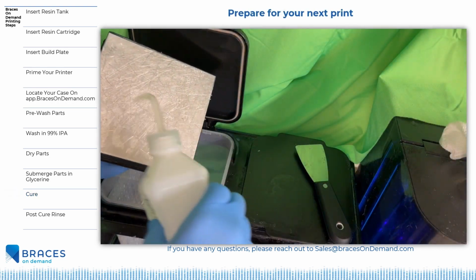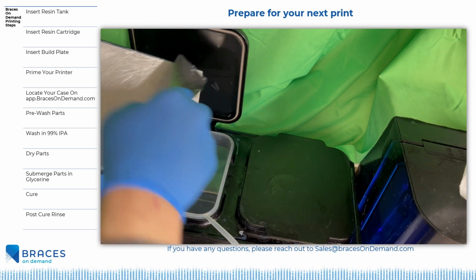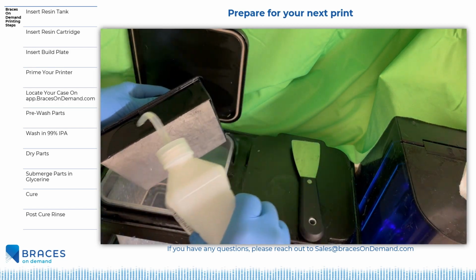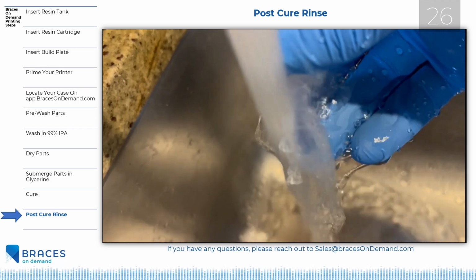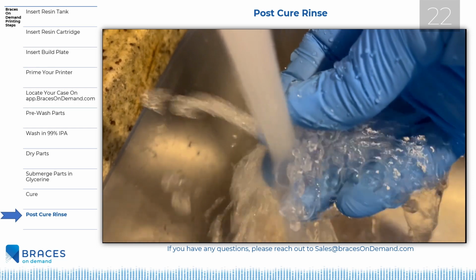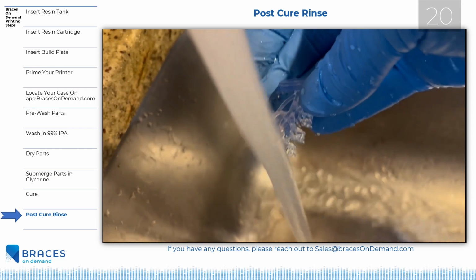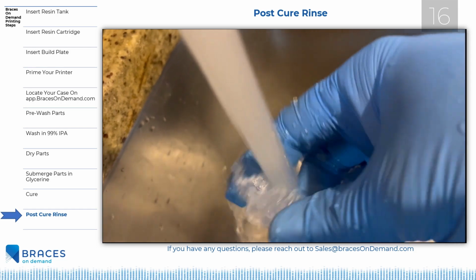While your parts are curing, this is a great time to clean your build platform and prime your printer for your next print. Rinse each part under warm to hot water for 30 seconds. Congratulations, you are nearly finished. After rinsing for 30 seconds, gently blow dry your parts and place them on a clean surface to dry.